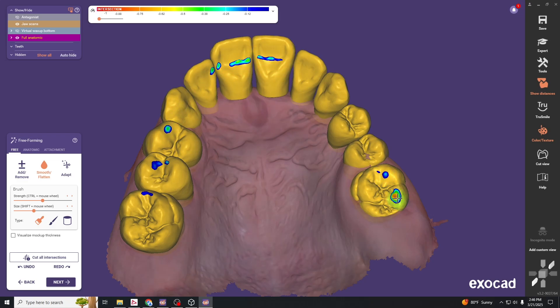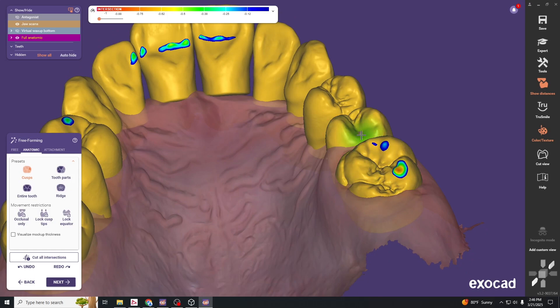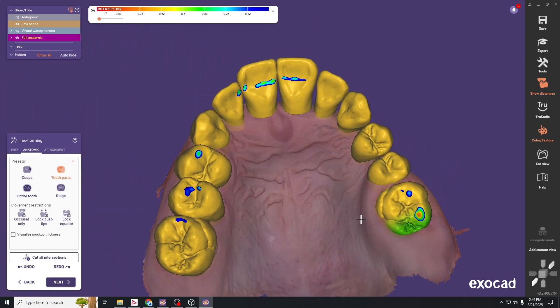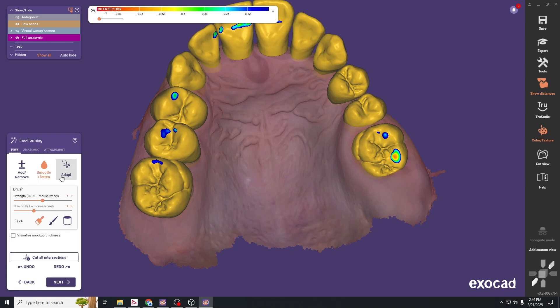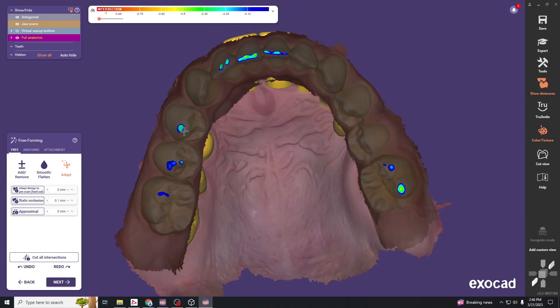If there are any perforations — areas that are too thin — add material there, or grab a cusp tip and raise those areas. Once we're pretty close, go into the adapt feature. Under adapt, you can adapt the static occlusion, which makes a direct cut to the opposing tooth.